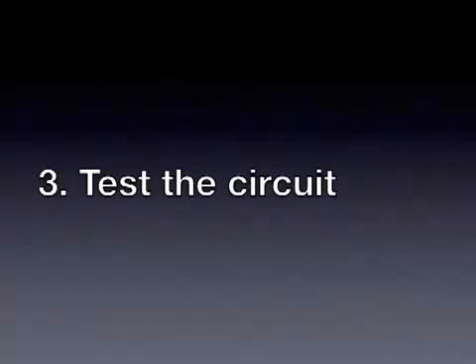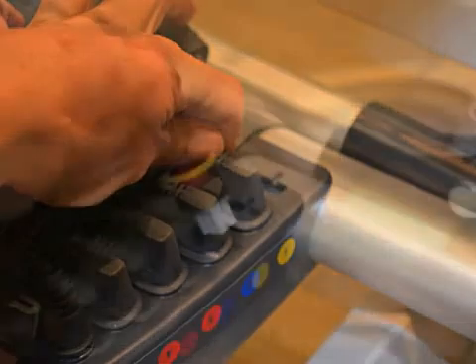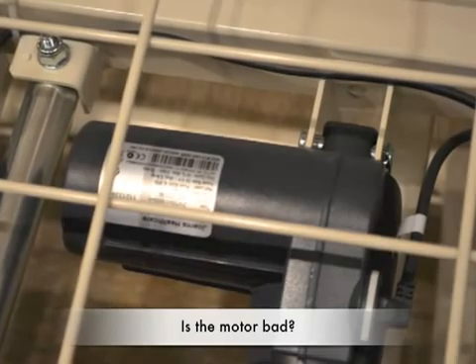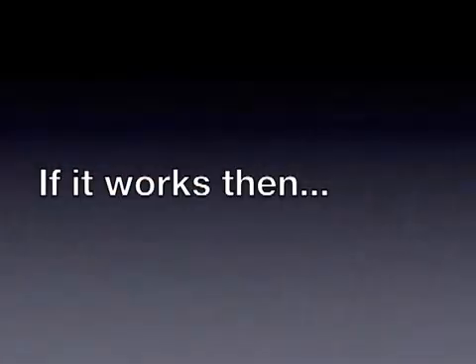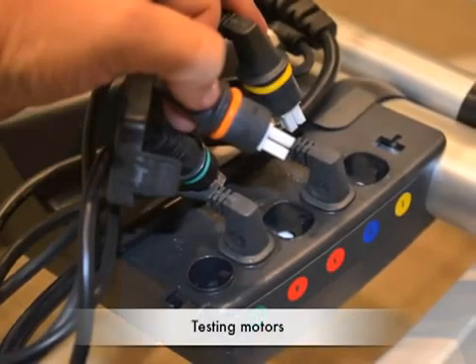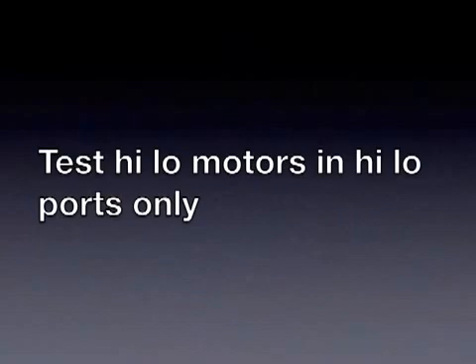Next, let's test the circuit to see if it is working. To do this, unplug one of the motors that is working correctly and place it in the outlet that is failing to operate. This process will help to diagnose whether the motor is bad or if the circuit within the control box is what is causing the problem. If the motor fails when it is plugged into another outlet, the problem is with the motor. But if it works, then the motor is good and the trouble stems from within the control box. You can test any motor in either of the 2 high-low ports, but if you test the high-low motors, they can only be tested properly in another high-low port.